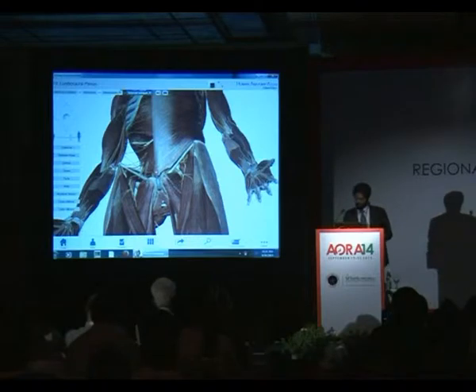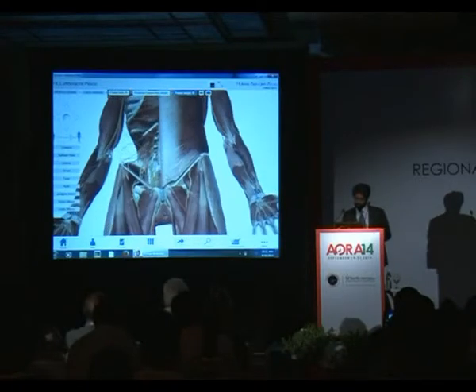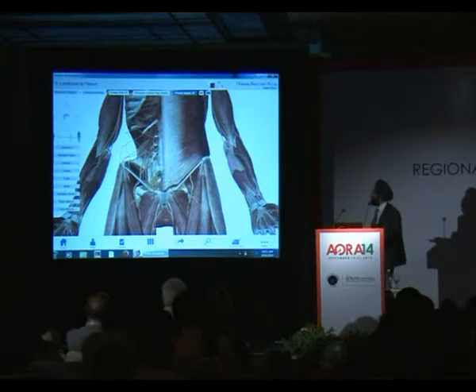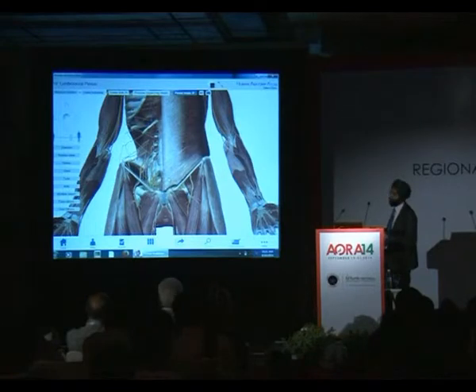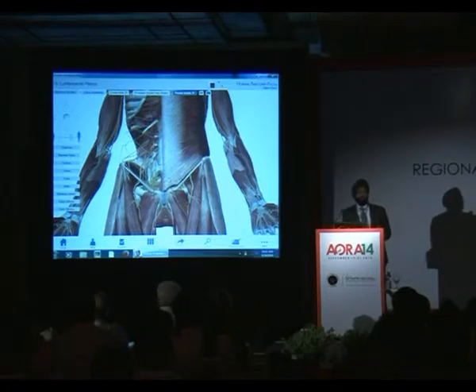And if I take off the psoas major from here as well, the local anesthetic is coming through here. We are putting about 40 mL, which you imagine is two big syringes of 20 mL local anesthetic. It doesn't have much option but to go there and block the nerves of the lumbar plexus. So this fascia iliaca block is actually a very attractive alternative approach of doing an anterior lumbar plexus block.